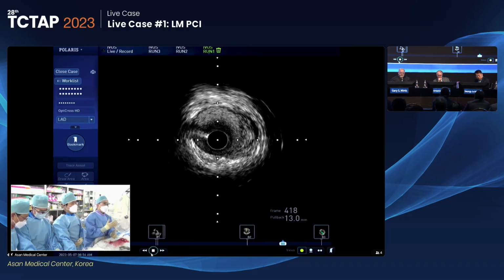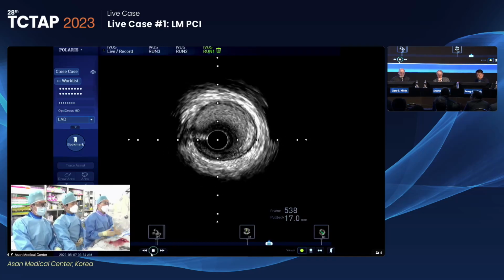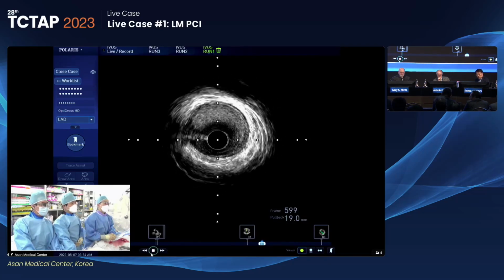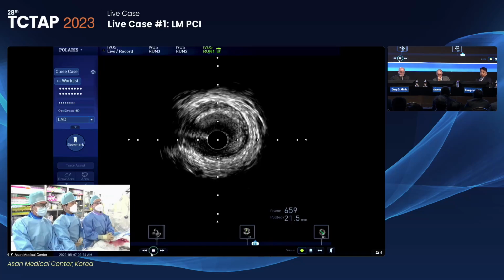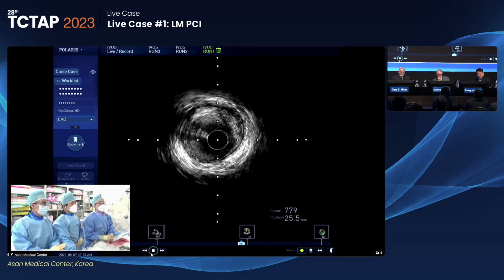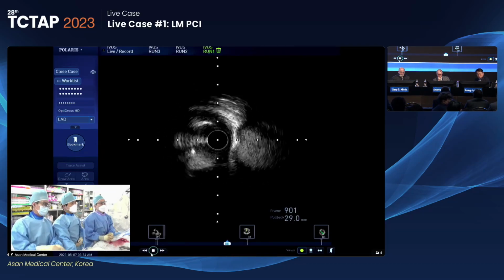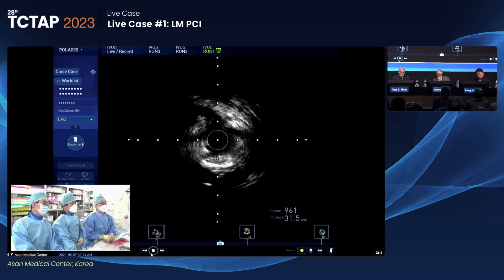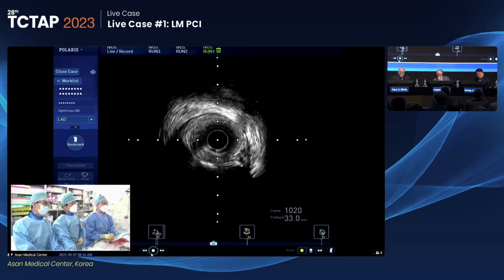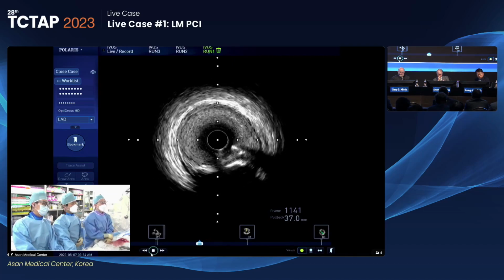And just distal to the LAD at the diagonal branch, there's another normal zone. 3.0 vessel. Yeah, about 3.2. And the plaque begins, and not very heavily calcified here. You can see eccentric calcium, and the diagonal branch comes from the 9 o'clock and septal from 3 o'clock. And here is the tightest region. This is the pre-balloon image. I did not perform balloon.